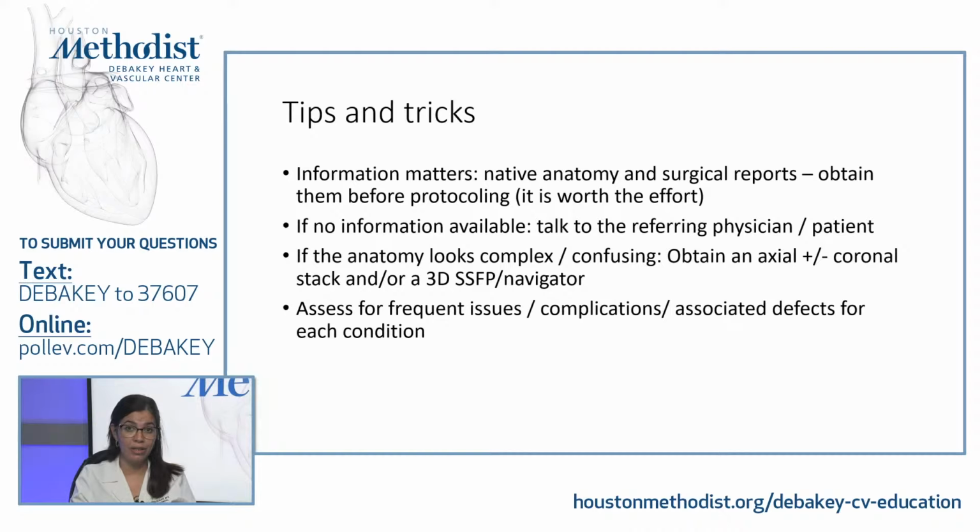and for those cases, the congenital imager needs to be by the scanner, supervising and helping the technicians acquire the right sequences to answer the clinical questions. So we need to obtain the report and the surgical and clinical notes before protocoling. It's really worth the effort.